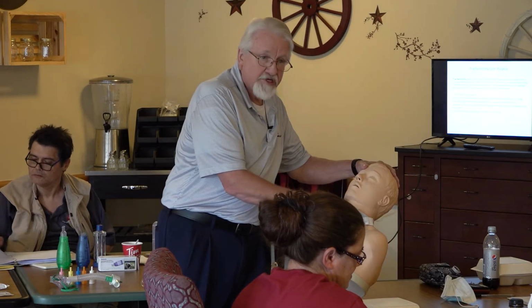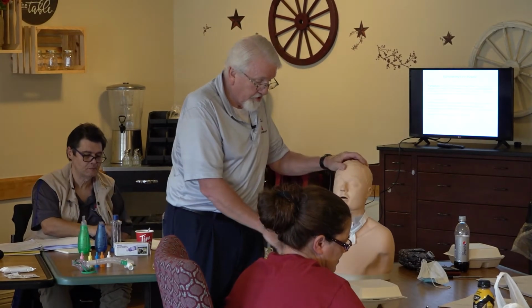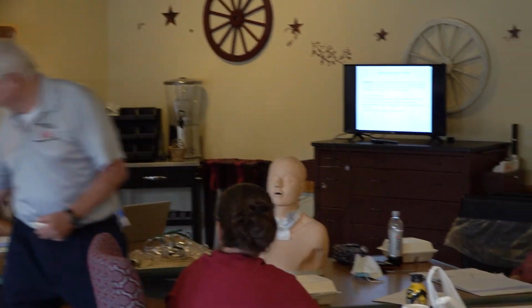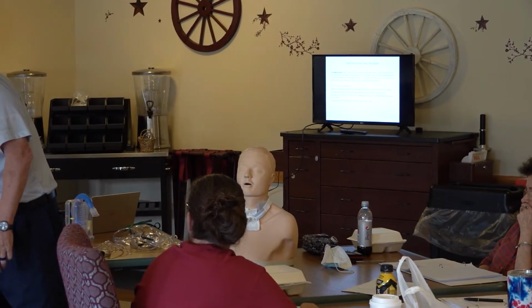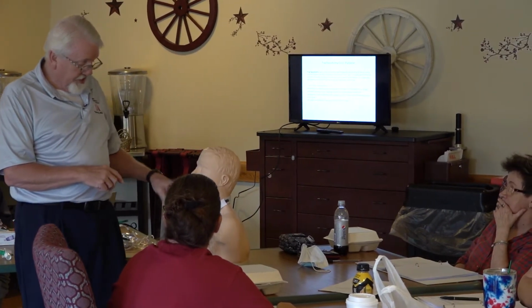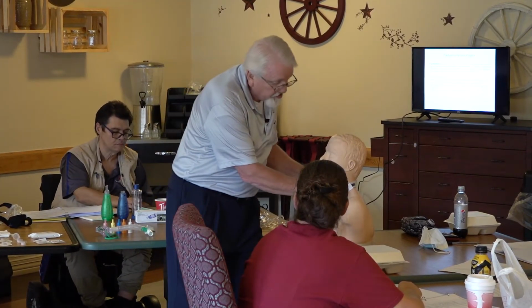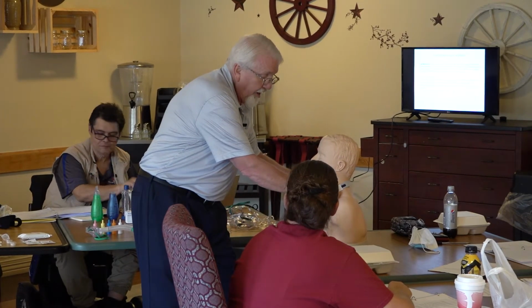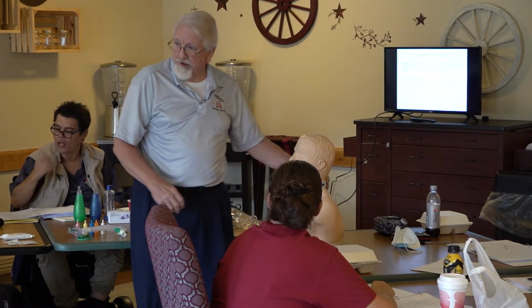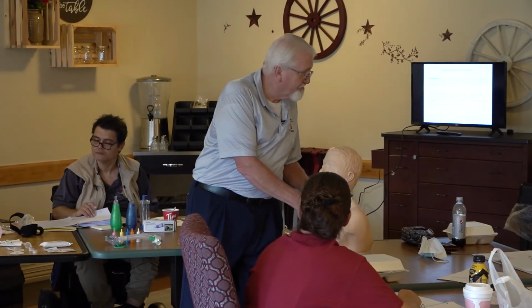He's done, and I'll put his trach mask back on, and we'll make sure he's comfortable and everything. And he reminds me, my collar's tight, my collar's tight. So I get all my stuff picked up, cleaned up, garbage thrown away, what have you. And what I'm going to do to help him, I'm going to tell him, I'm going to fix this for you, Bob. So I'm going to grab the collar on each side, and I'm going to pull it forward, okay? And all I'm doing is stretching this back here a little bit, but it releases some of the tension on the front. And he goes, oh, that feels better.